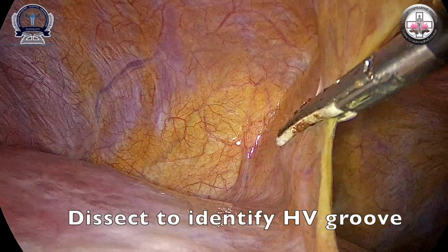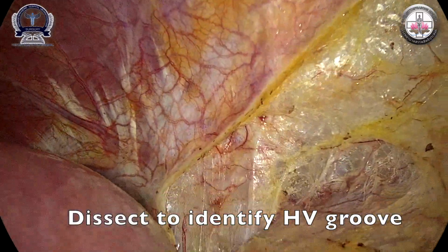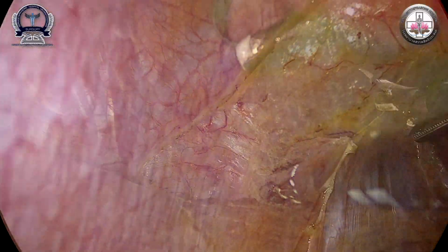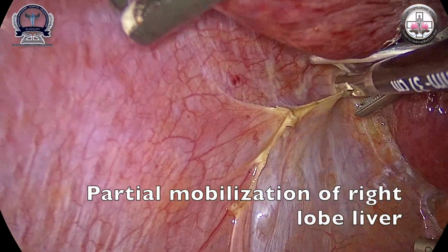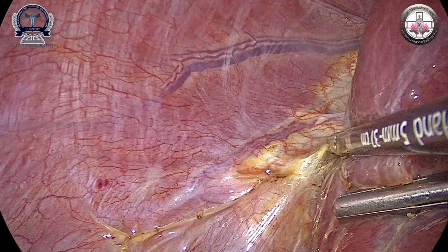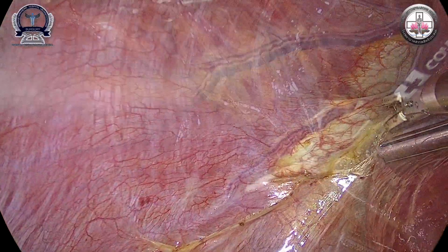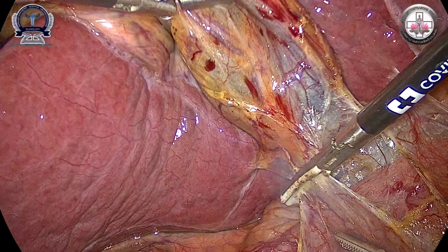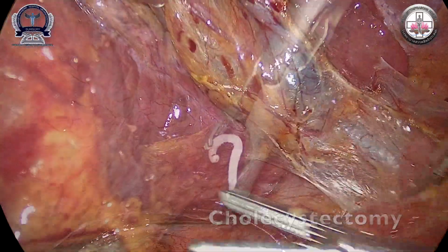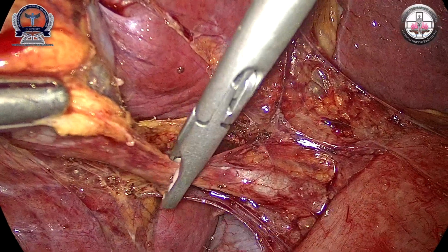The procedure was started with mobilization of the liver and identification of the hepatic vein groove. Partial mobilization of the right lobe of the liver was performed. Cholecystectomy was done to expose the right portal pedicle.